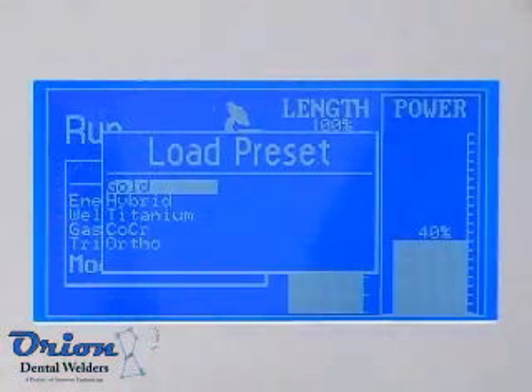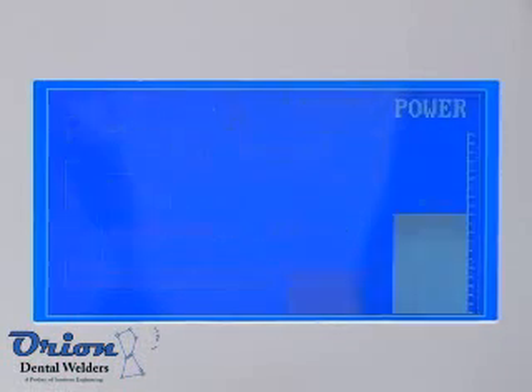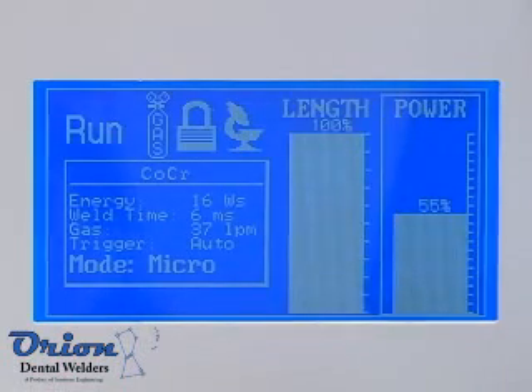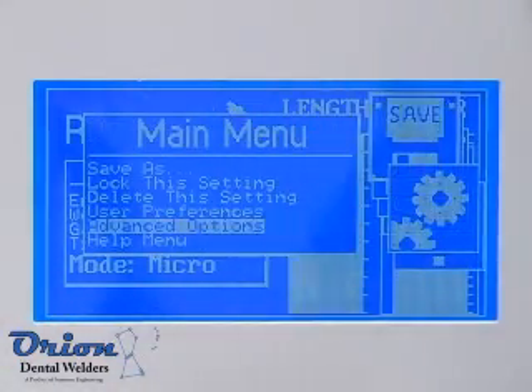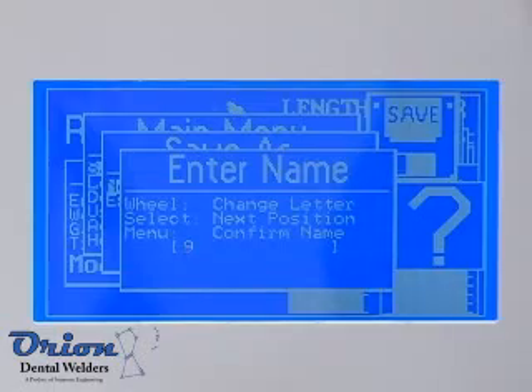The Orion Dental Welder has 15 welding presets to help you get up and started right away. Choose from cobalt chrome to orthodontic wire welding. Once you have found the perfect setting for your application, save it at one of 15 customizable settings and retrieve that custom setting at the touch of a button.